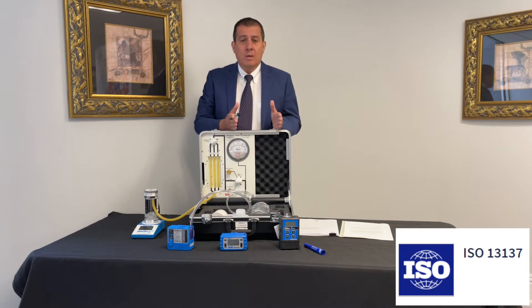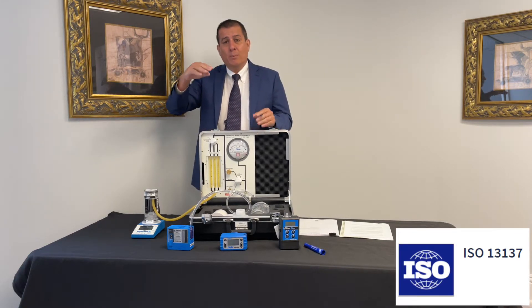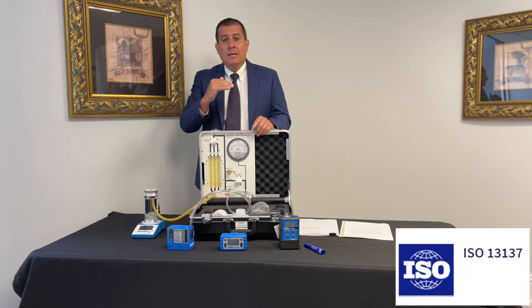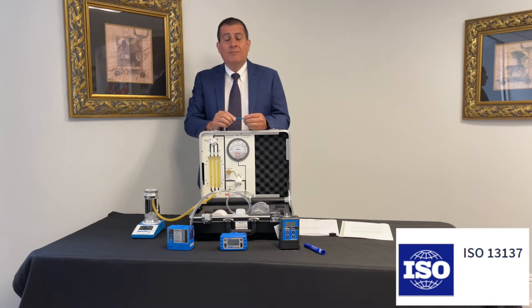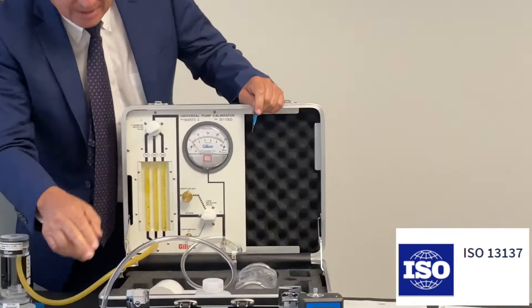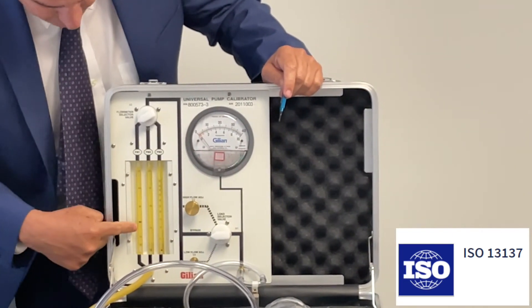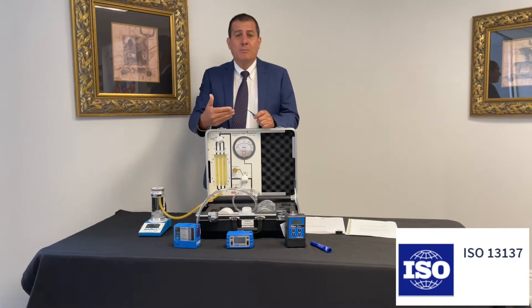Number one is constant flow. Constant flow means no matter what happens to a pump — where the filter gets clogged, as the filter gets clogged and pressure increases — the pump must be able to maintain the same flow rate. Constant flow means that once you set the pump, in this case it's two liters a minute. This is the Gilair 3, two liters a minute. This pump will maintain the flow no matter how much back pressure you generate.